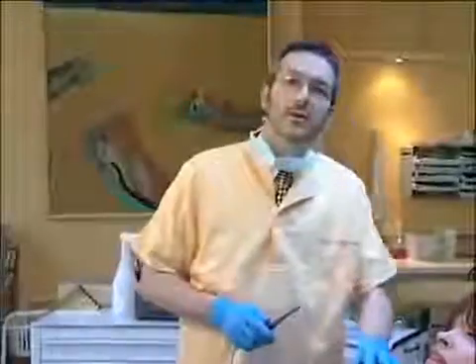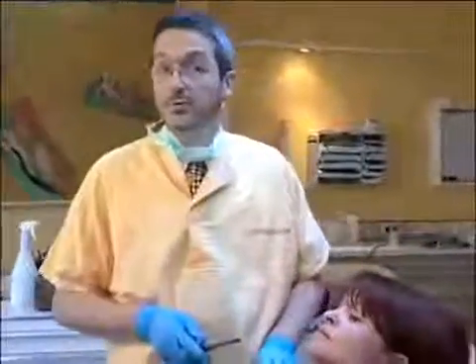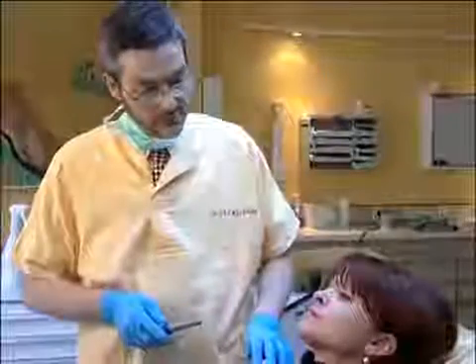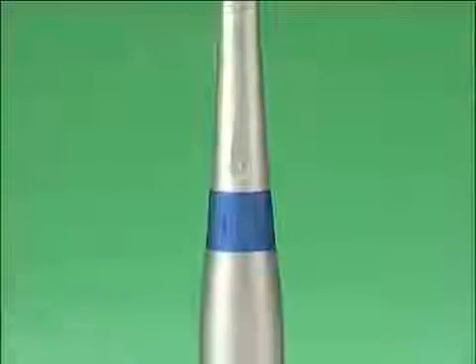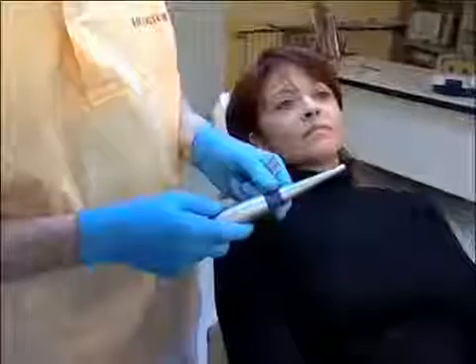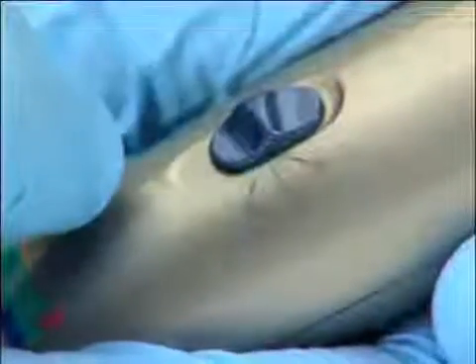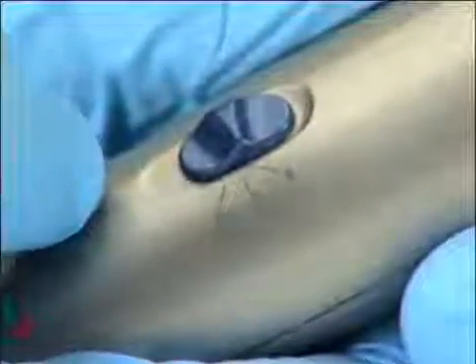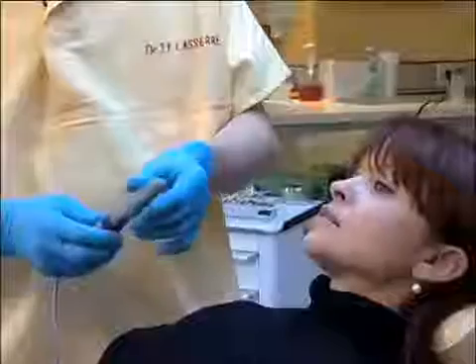We are going to show on this patient the different steps of the selection of the base color for a tooth. In this instance, central incisor number 21 using the Sopro 717 camera's Sopro shade function. The Sopro shade 1 button is set to intermediate position, and the tip designed for shade selection, the Sopro shade tip, is placed on the camera head.